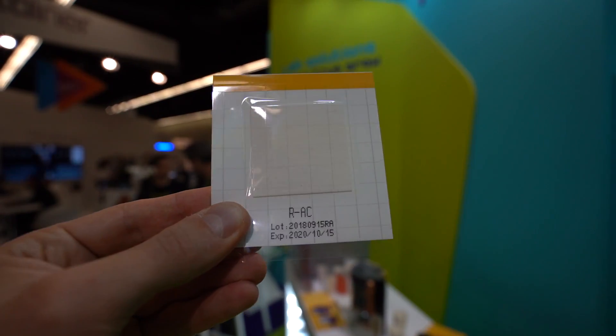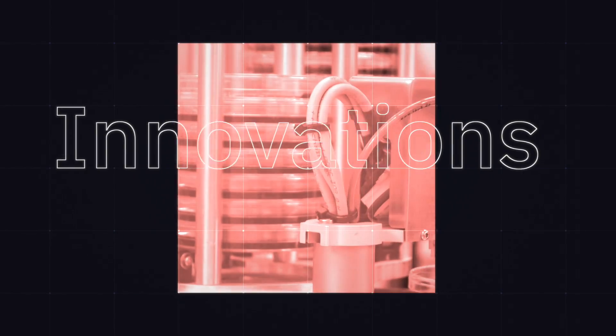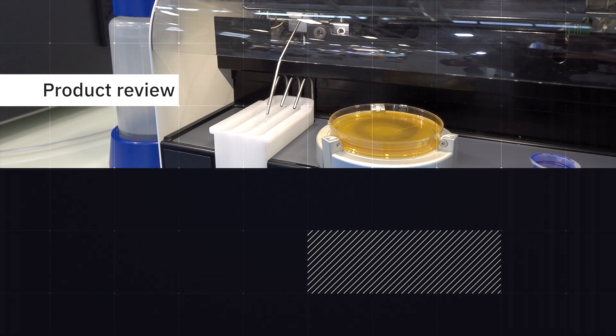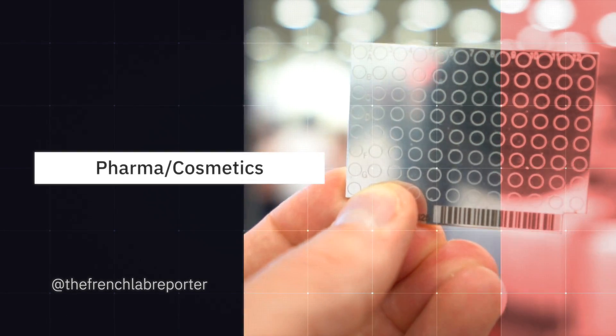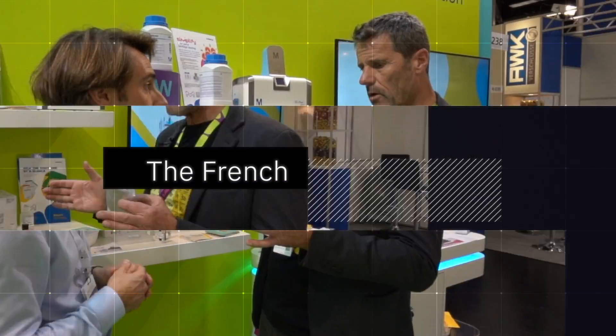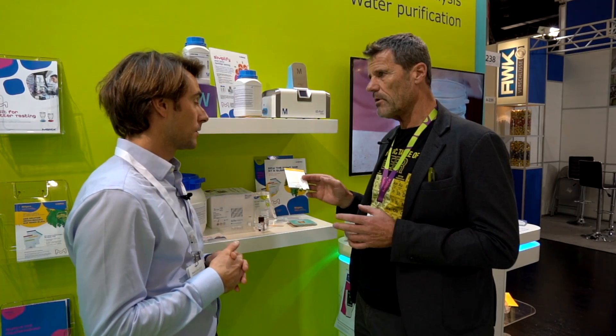Hello everybody, I found a new product on a booth. I know you will say it's not pretty new, you know it already — but it's not the same as from Merck. We have here the MC media pad for several purposes in microbiological diagnostics or analysis. At the moment we offer this product for total count, for yeast and molds, and for differentiation of E. coli and coliforms.